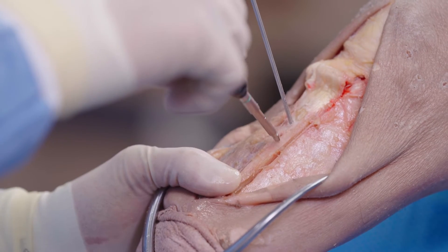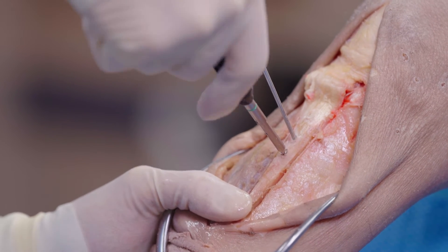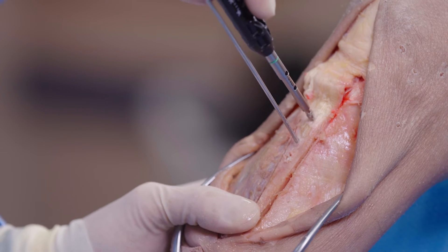We're going to be using the Kinemed MD3T system, which is a nice low-profile system. Now we're going to focus on the osseofiber screws. We're using 4-0 headless screws. I'm going to countersink to start — I always plan on about four millimeters — and that will take care of our headless screws. I'm just countersinking right now, going through the screw holes that have already been created.